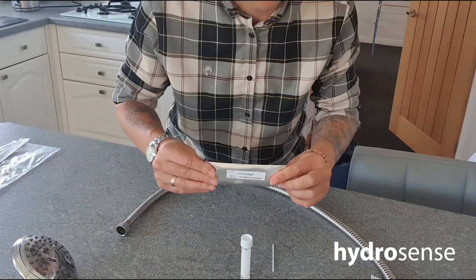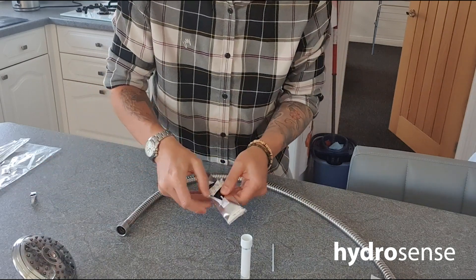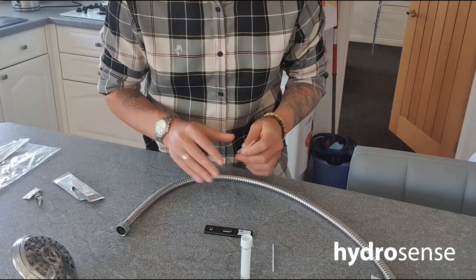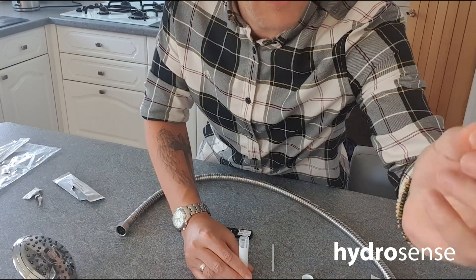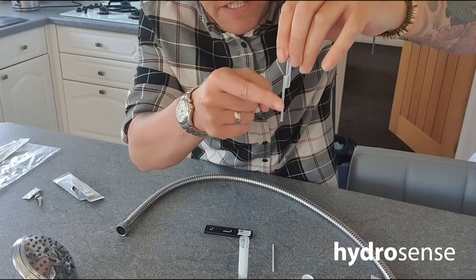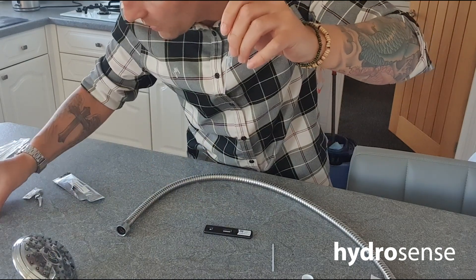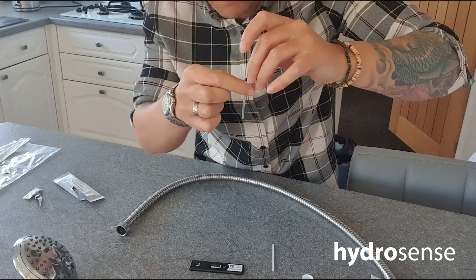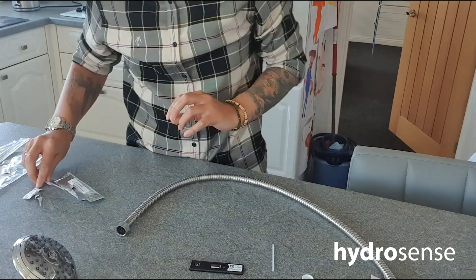Next we take the HydroSense out of the wrapper and place it flat on the bench. Inside the wrapper we have a pipette. Take off the lid and, squeezing the bottom section, we take one tenth of a millilitre by filling up the stem with the solution. Once the stem is full, we don't squeeze the reservoir — the middle section — just the top, just to empty the stem onto the first window of the HydroSense. Give it a squeeze to get all that solution out.